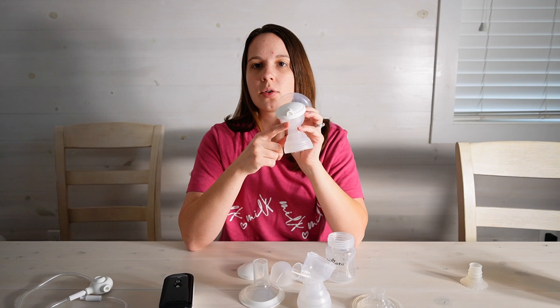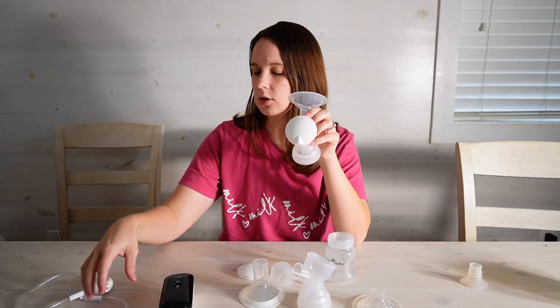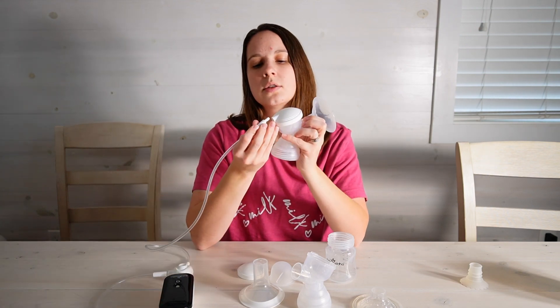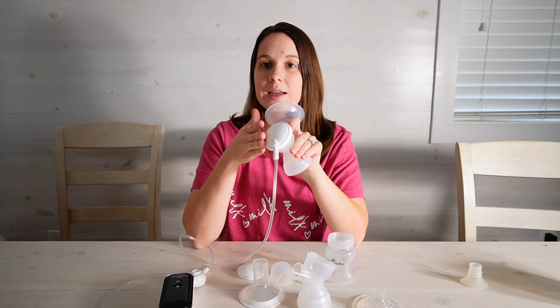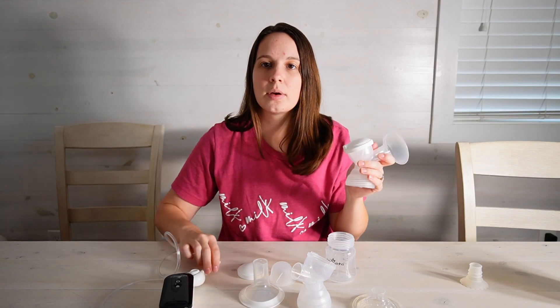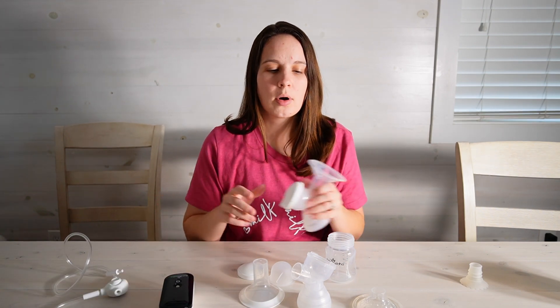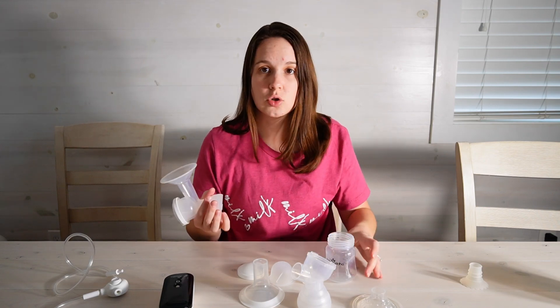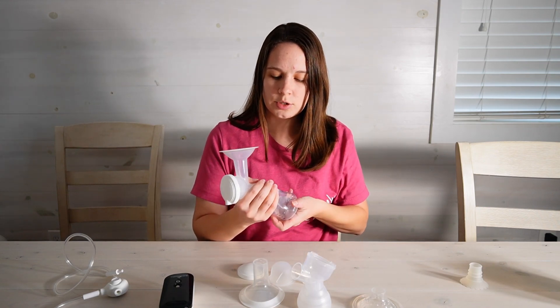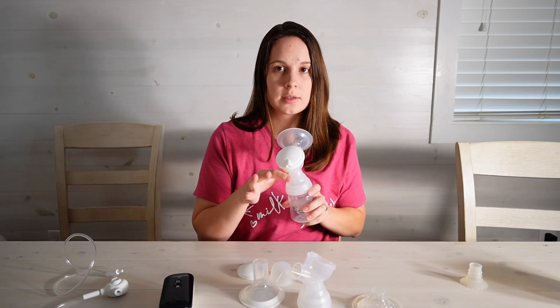You'll feel a little click, but we want the tubing connector to be in line with your flange. If you have it turned to the side then that ends up warping the parts and stretching out that diaphragm. So just make sure that that cap is straight back.